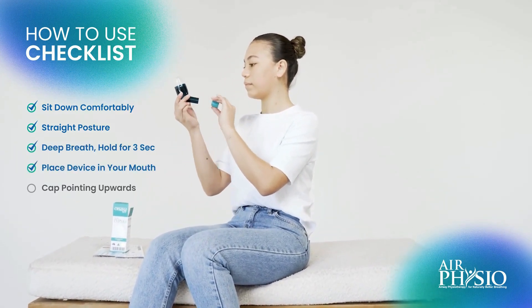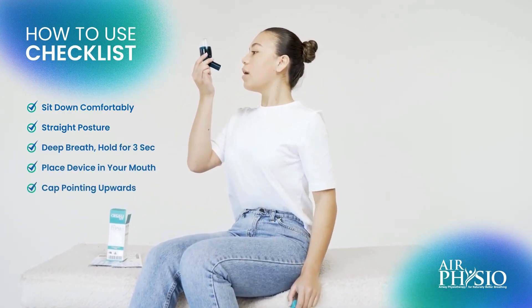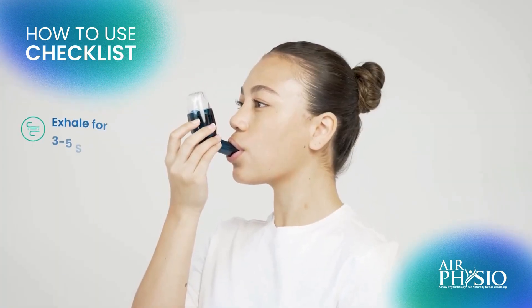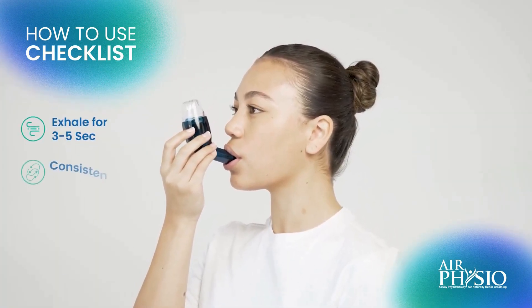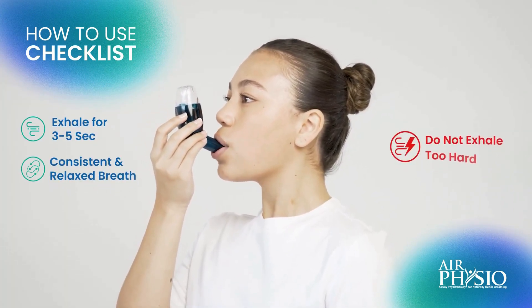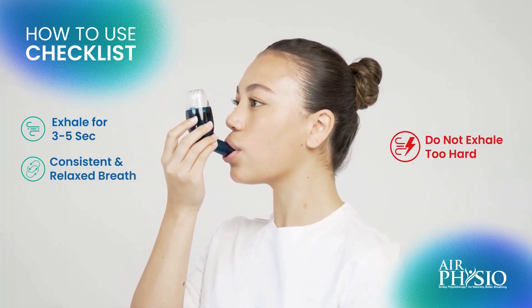Place the Air Physio in your mouth and lift the clear cap toward the ceiling or sky. Blow into the device for 3-5 seconds with a consistent and relaxed breathing. Do not try to blow too hard trying to lift the ball bearing on the first breath.